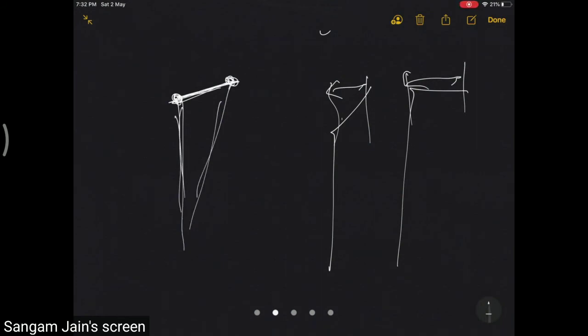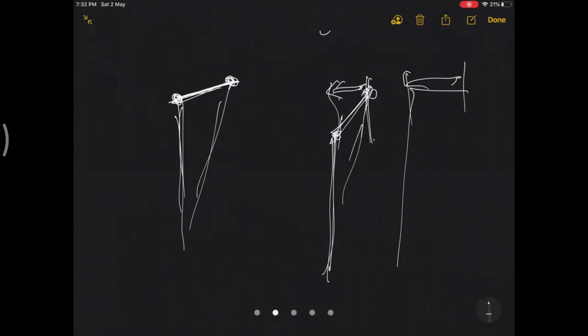If you have a coxa valga, the horizontal offset is less, so the center of the head and the anatomical axis are somewhat close. In this condition, this angle seems to be less. So if you still take a 7-degree valgus in them, they will have some kind of knock knee.